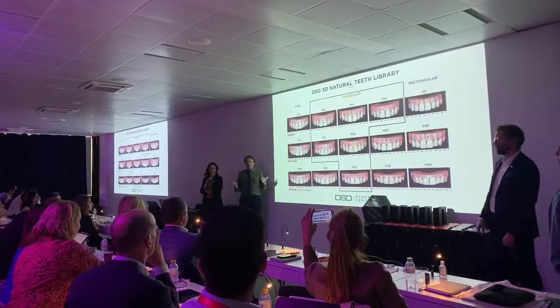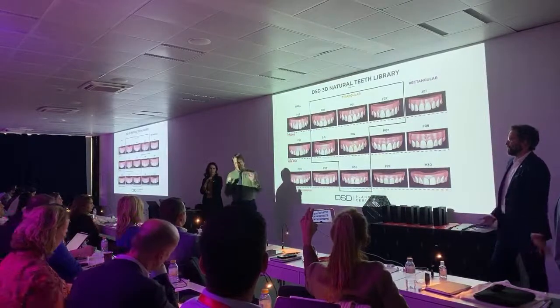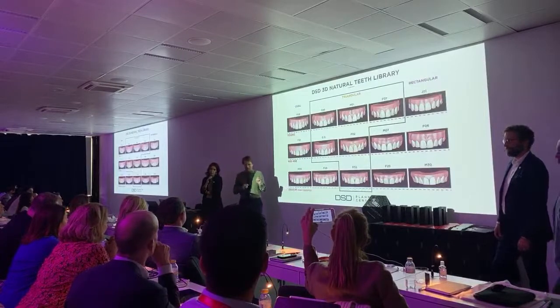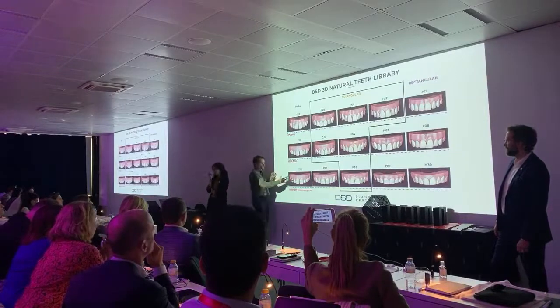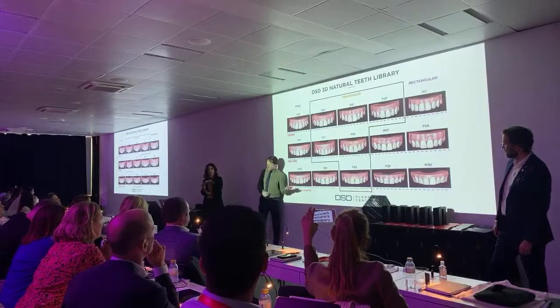It's messy to pick. Makes no sense. A face photo, smile, and a nice intraoral scan, right? The scan needs to be in high definition. And what we're going to do is that even if we already have 2 here, if yours is better, we take one out and we bring yours, right?